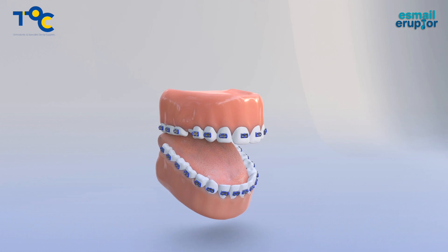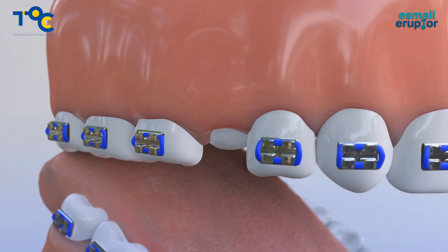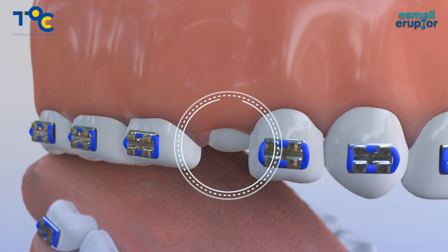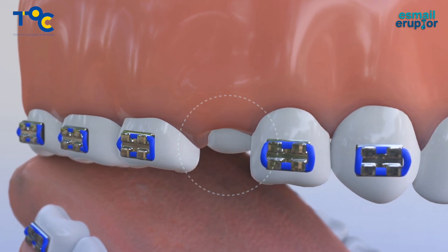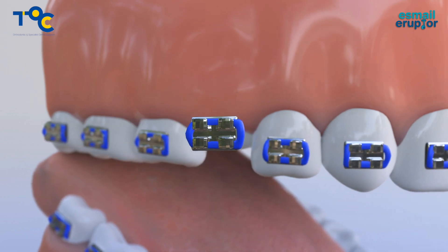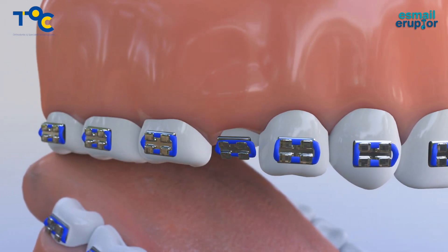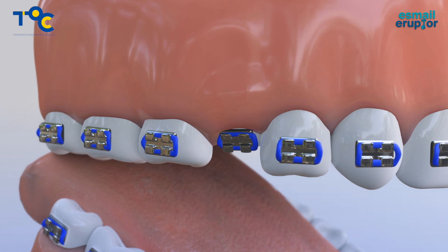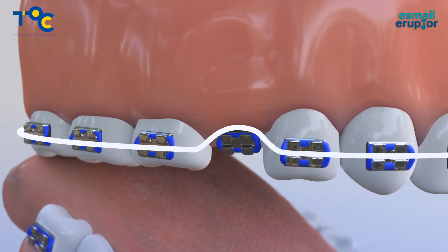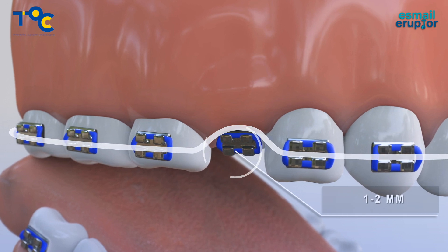Partially erupted teeth can be time-consuming to align because we can't place the brackets on the FA point of the tooth, and there's only limited enamel to bond to. Placing a bracket on the exposed part of the partially erupted tooth will only allow minimal wire activation. Engaging the wire above the bracket will also only allow a small activation.